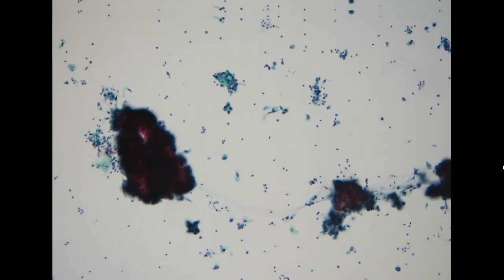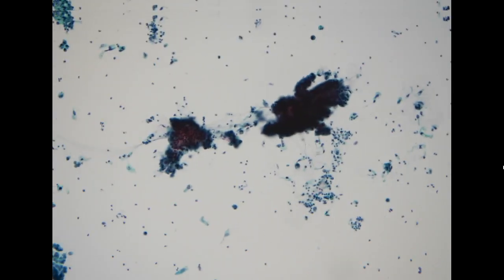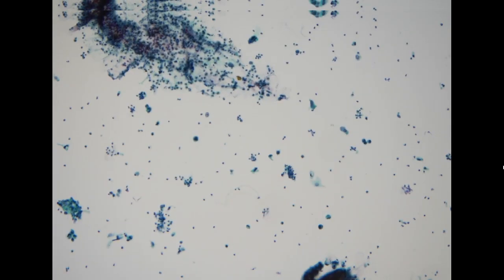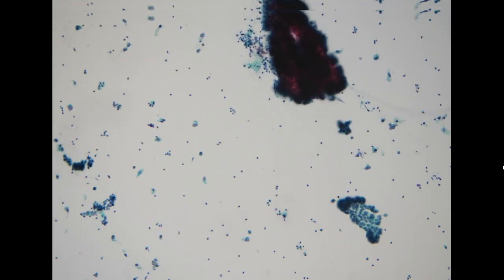We also received the renal pelvis washing from the same site. For the renal pelvis washing cytology, the atypical cells are not as common as what we see in the ureter, which means the lesion is likely inside the ureter, not in the renal pelvis.